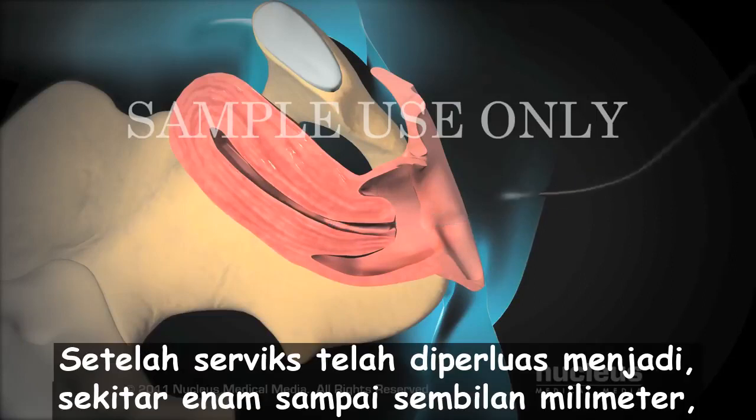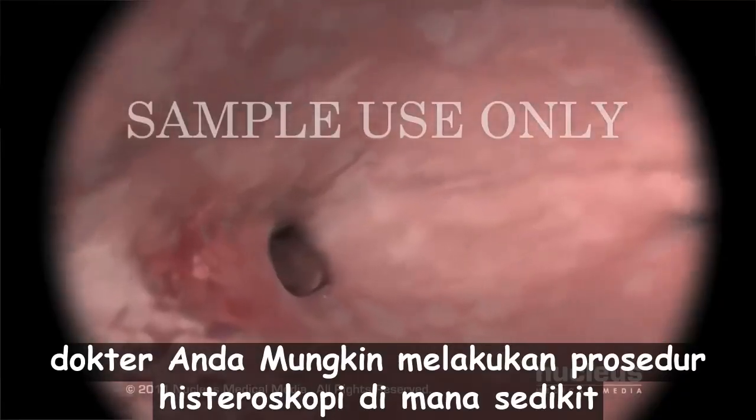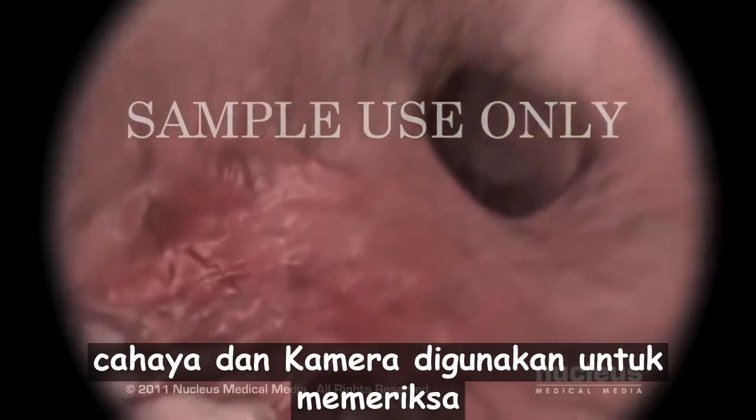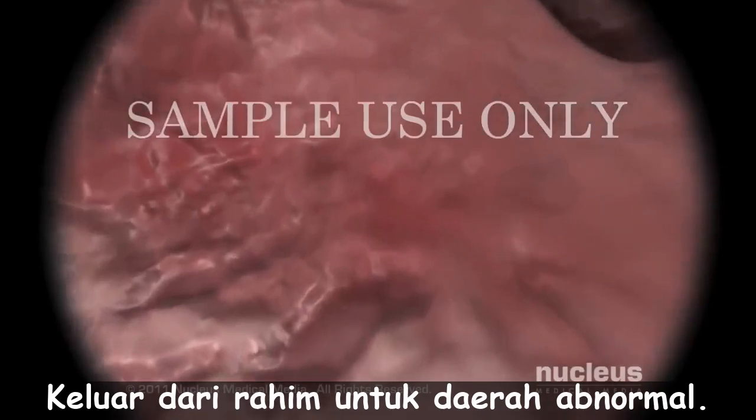Once the cervix has been expanded to about 6 to 9 millimeters, your doctor may perform a hysteroscopy, a procedure in which a small light and camera are used to examine the inside of the uterus for abnormal areas.